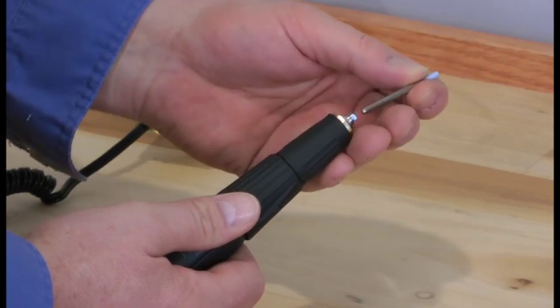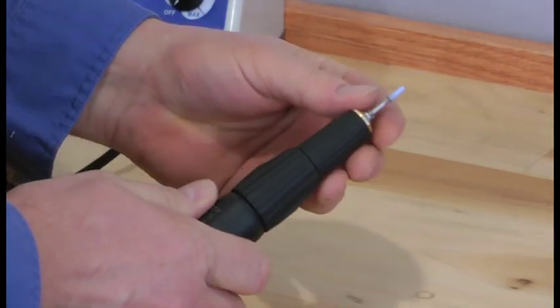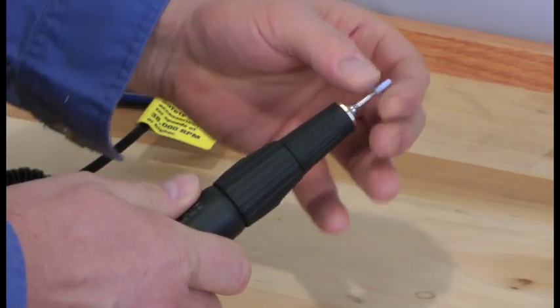You can pull out the burr, the collet's released. To put a new one in, just put it in, bring it over to secure and it's ready to go.